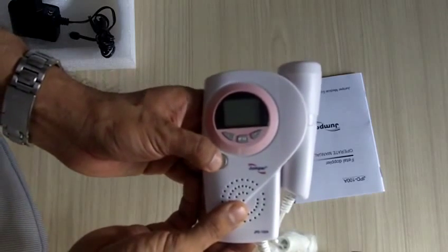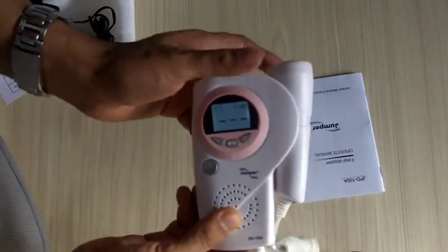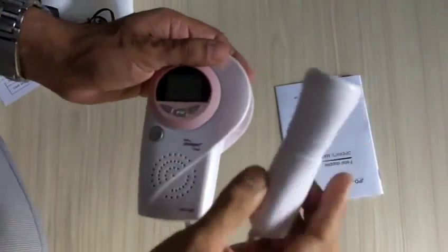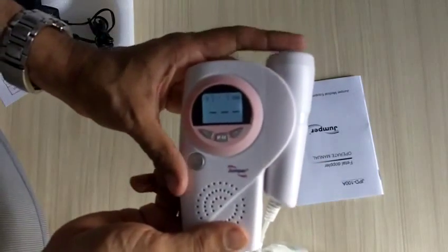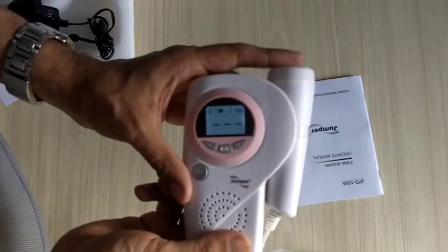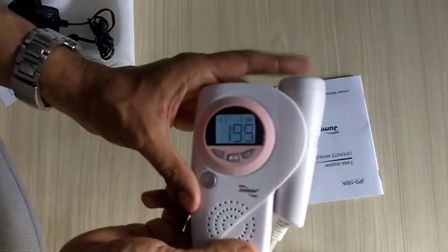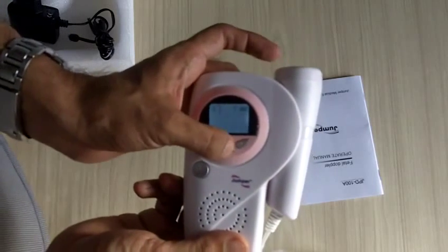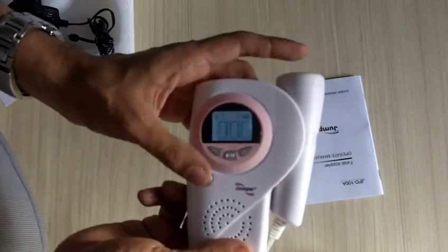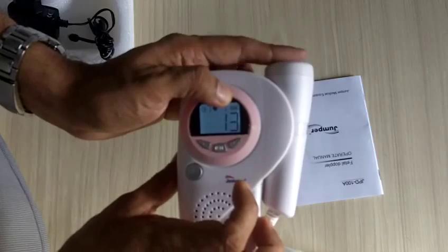To turn on the device, press the on/off button for about two seconds, which will start the machine. You can then take the probes — if you are getting a very loud sound, it will start giving you the readings, which are backlit and very easy to see.